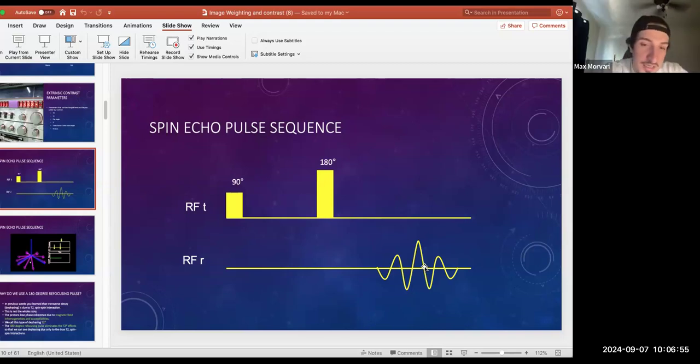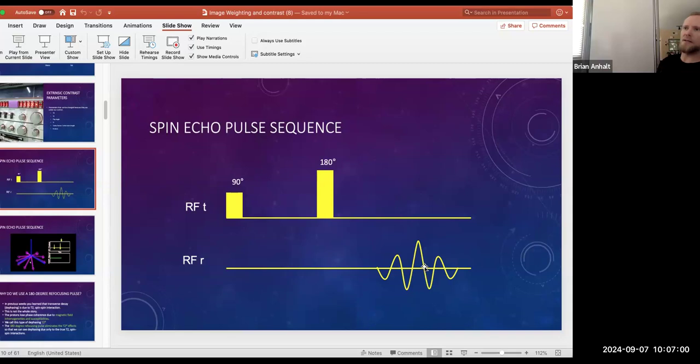Brian, can you repeat that? It detects digitized what? K-space is a mathematical place where we take digitized waveforms and turn them into an image. So it's basically just a place where we put all the raw data, right? We have to turn on the coil to get the signal back from the patient. That signal is measured and put into K-space. Just a mathematical plot, essentially. It doesn't look like anything to us, but it's essential in the image creation process. And K-space has to be symmetrical. There's got to be some symmetry involved in it.